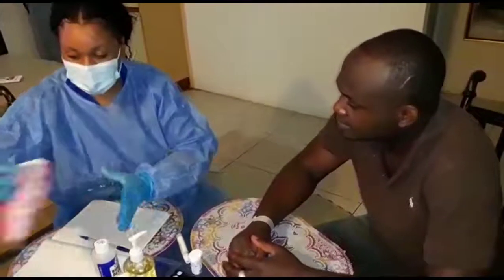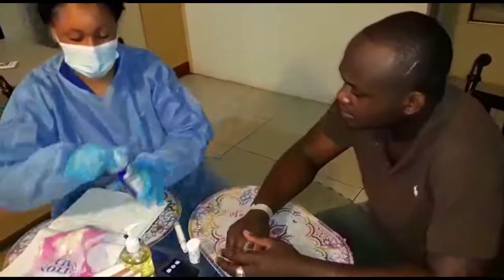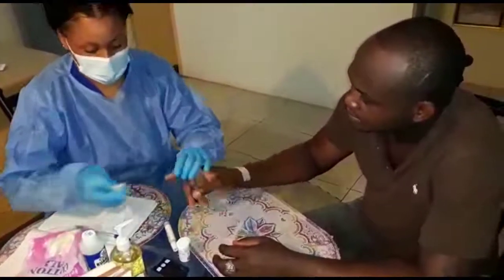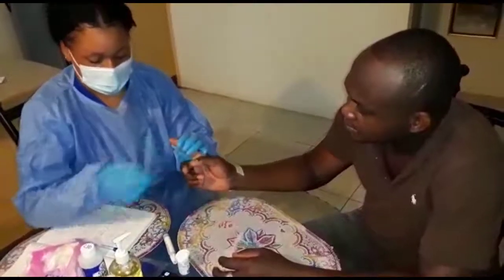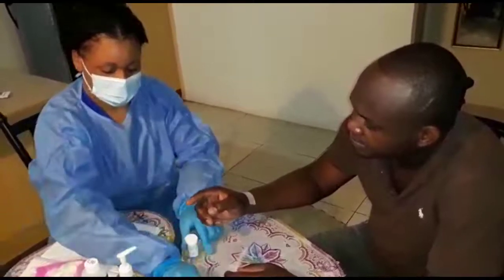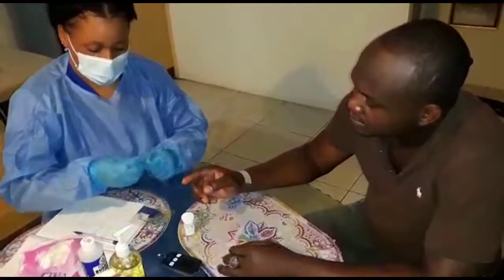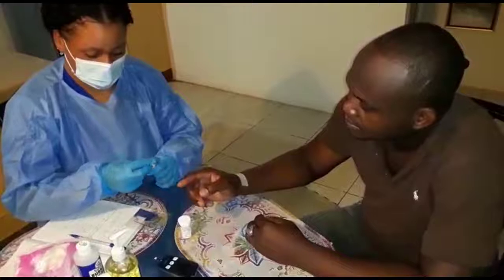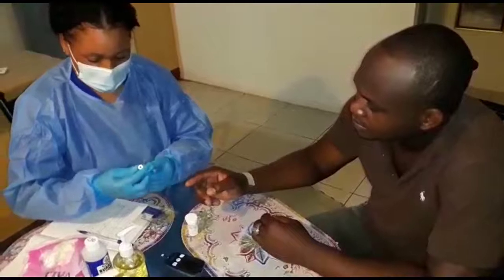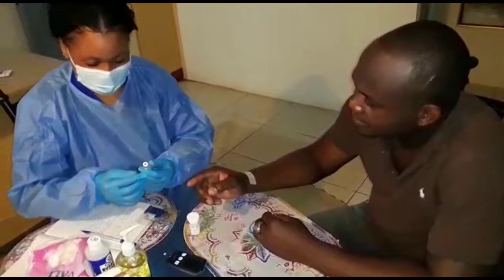Okay, so I'm going to be wiping your finger with just a little bit of alcohol, just to get rid of any debris that is on the fingers. And then I'm going to allow it to air dry for about 2 seconds. Alright? And then I'm using a single-use needle. And I'm going to adjust the prick. I don't want to give you a deep prick. Okay, sure. Alright.